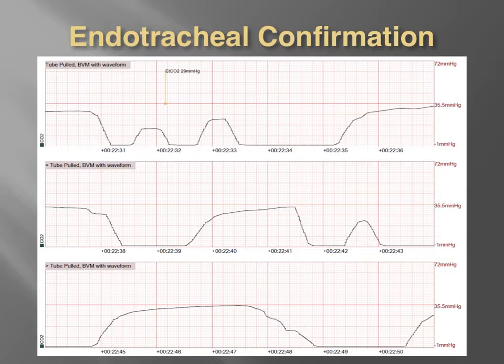But even more to point out is this waveform right here. See how it's kind of sloping? It's sloping a little bit because we have a delayed exhalation all of a sudden. Well, why do we have a delayed exhalation? Well, we're bagging with a bag valve mask, so we can't really diagnose bronchospasm with just the bag valve mask without that controlled airway. We could have a tongue falling in the back of the throat. The airway might not be open completely, like a head tilt, chin lift kind of thing, jaw thrust.